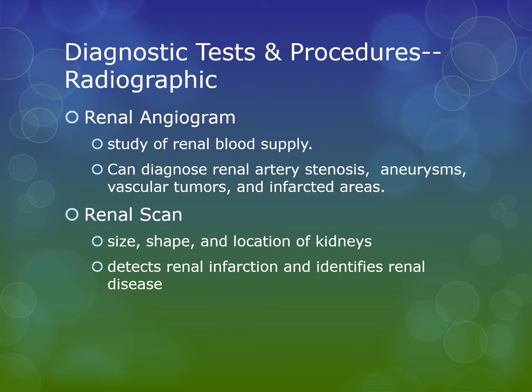They look a little weird when you're doing it that way, but I'll show you a normal one, and then I'll show you all the ones that aren't normal, okay? It's also going to help detect renal infarction. It also identifies renal disease, and by the way, it does a really good job of showing us renal tumors. So if you've got a cancer or a renal tumor or even a very large cyst, it's going to do a really good job of showing that.